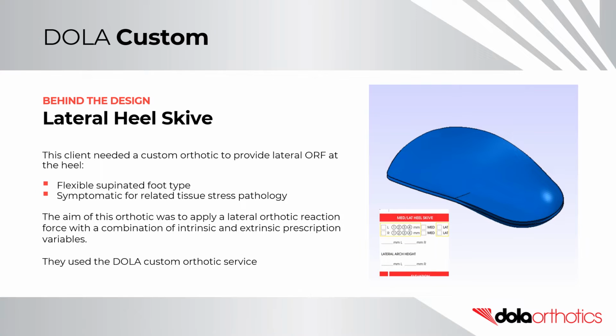Behind the design, lateral heel skive. This client needed a custom orthotic to provide lateral orthotic reaction force at the heel. It was in a flexible supinated foot type, symptomatic for related tissue stress pathology.